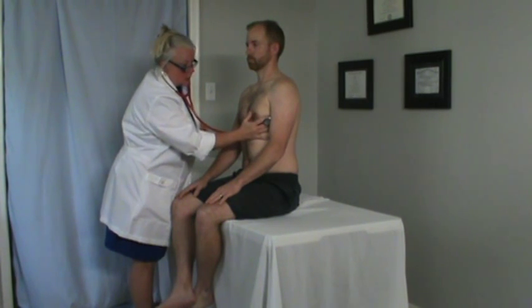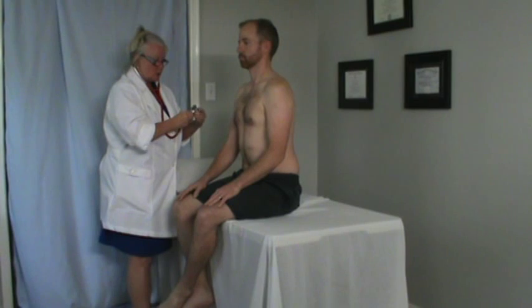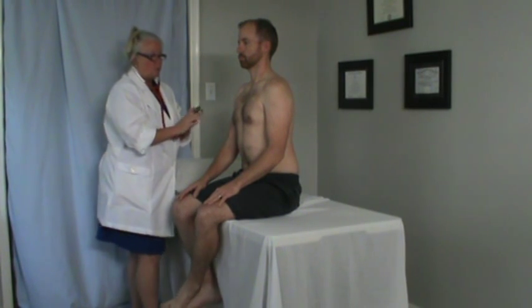We're listening for any extra sounds, clicking, or murmurs. And none was noted. We're going to listen again with the bell of the stethoscope at the same points.